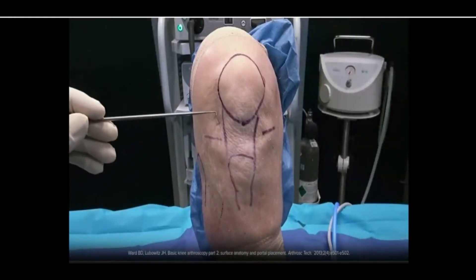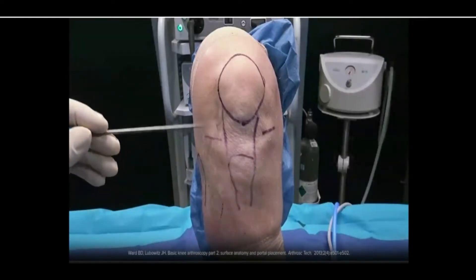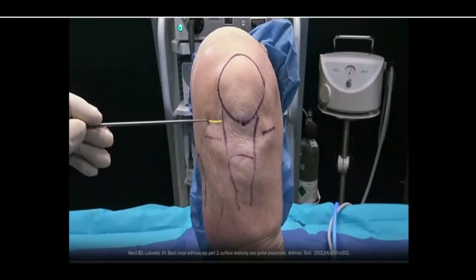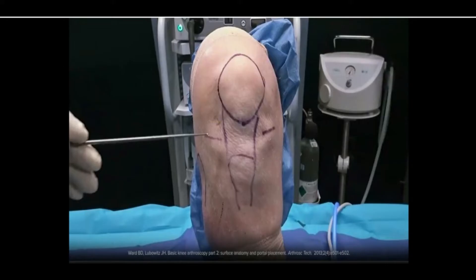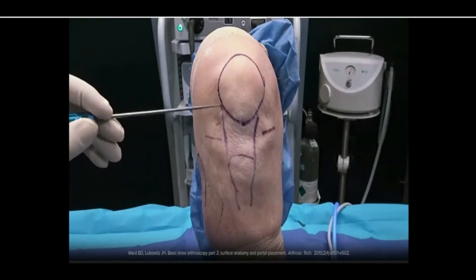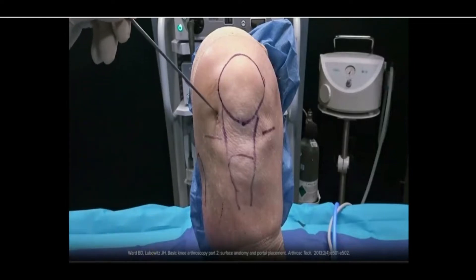Arthroscopic portals can be made in a vertical or horizontal fashion. Horizontal portals, although slightly more cosmetic when healed, can hinder use of instrumentation if made too high or low by creating a difficult trajectory to access the tibiofemoral compartments.